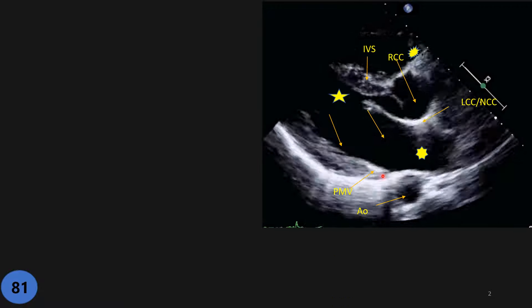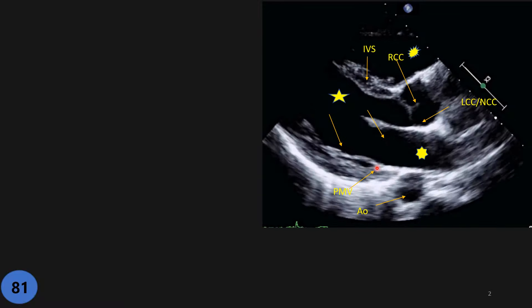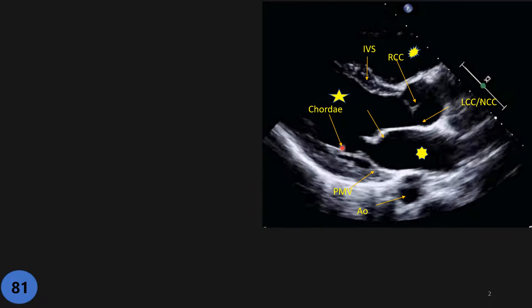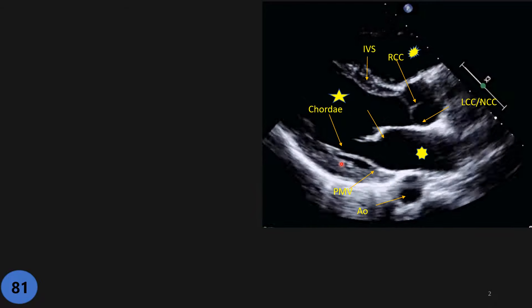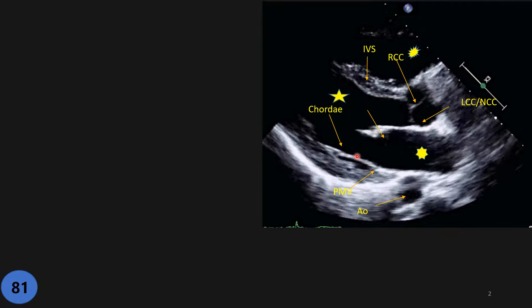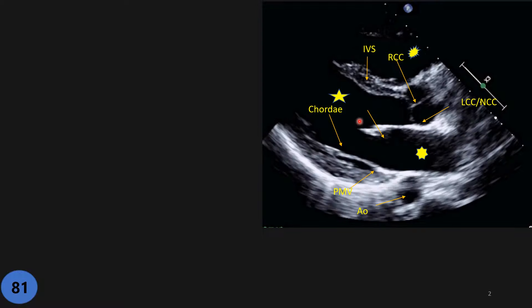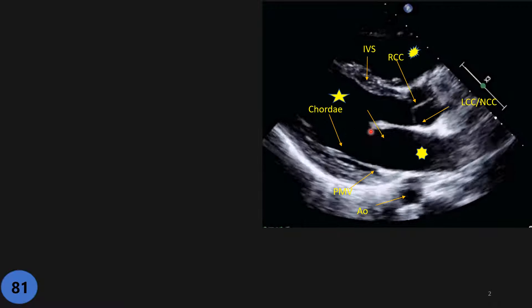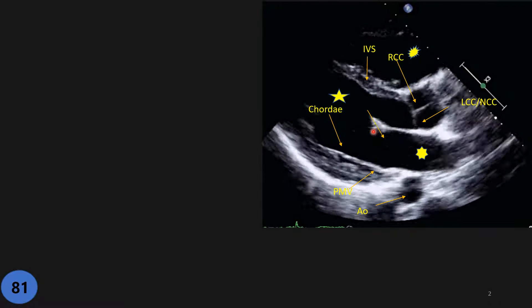We have the descending aorta — usually an oval shape, not completely circular — I'll explain why. Then we have the posterior mitral valve leaflet, short and posterior. And here we have a hyper-echoic line separate from the posterior wall of the LV — that is a chordae tendineae.